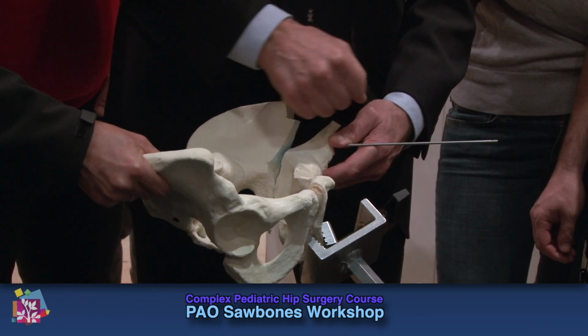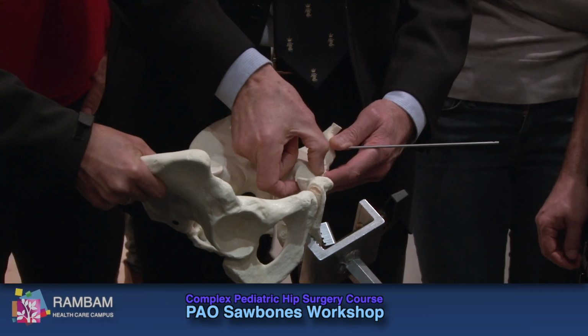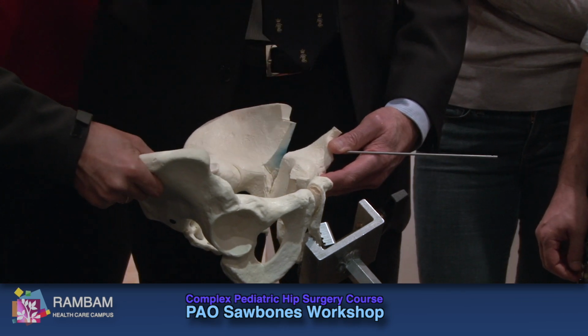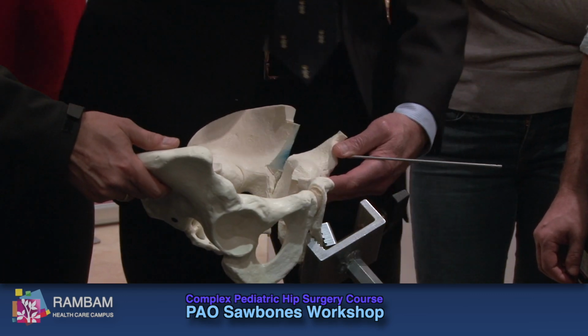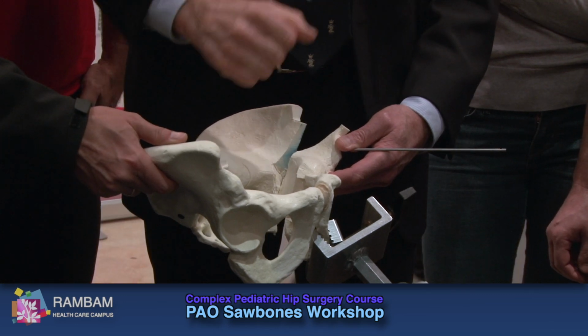So yeah, I do that, then push, and what you do is you saw on Scott's picture, he puts a little clamp around here. A little clamp around there, you can do that. And on the set also you'll see the set in live surgery, he has an instrument like this, with a little ball spike on it, ball pusher, and I use that to push. So I'm struggling, I use that to push.